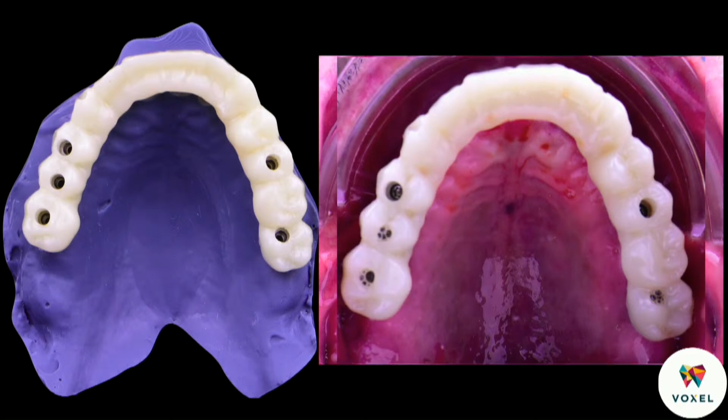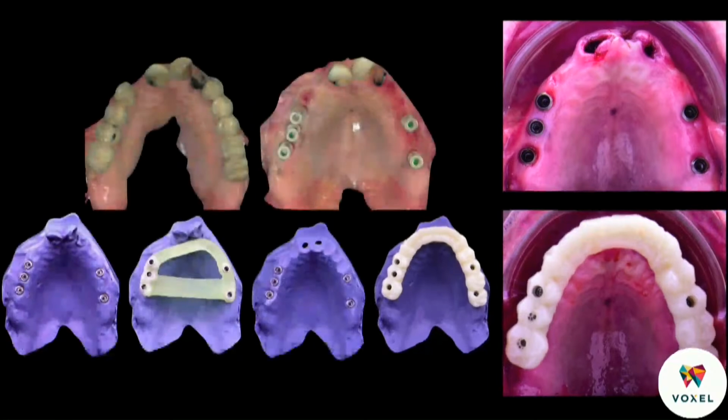And I'd like to thank my colleagues from Voxel for providing such a great service. This pretty much sums it up. You can see here that no single impression was done. So to me, this is what I refer to as a completely digital workflow for implant rehabilitation.